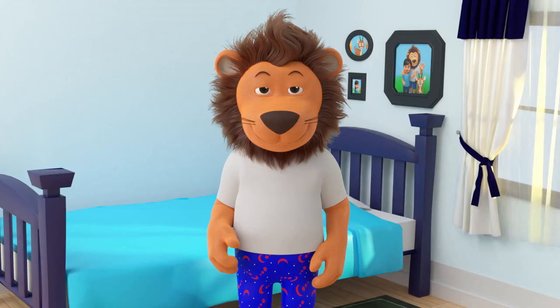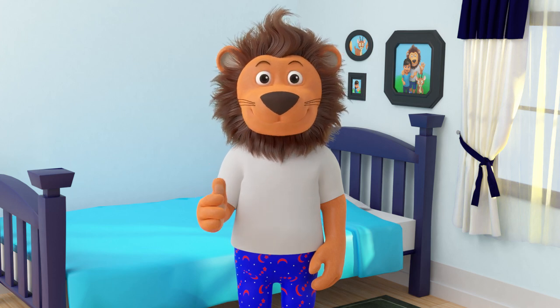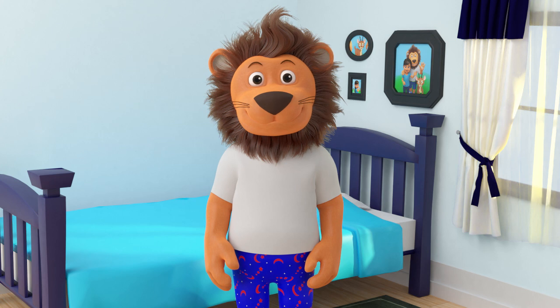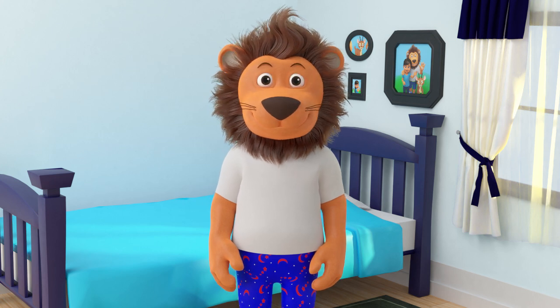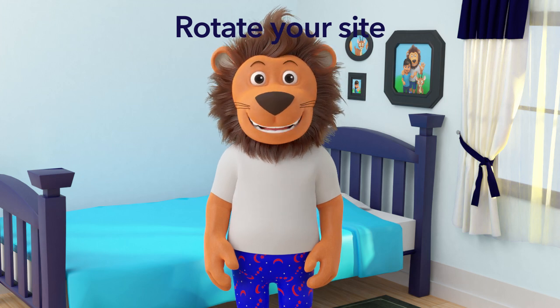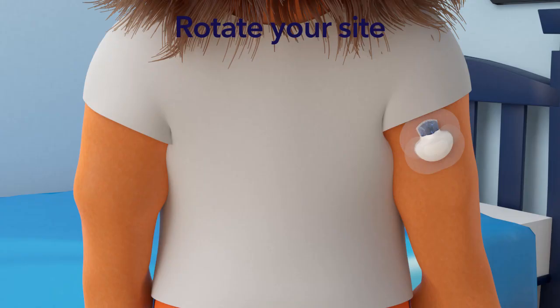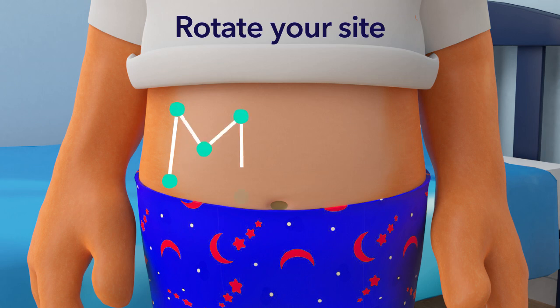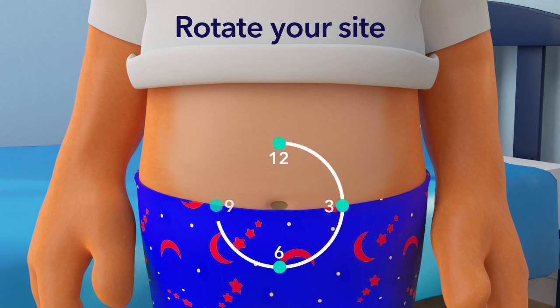Your parents may do this with you now, so you can start learning how to do it yourself one day. When you put the new sensor on, it needs to be placed in a new space on your body. We call this rotating your site. For example, if your old sensor is on your right arm, your new sensor can go on your left arm. You can rotate your site in an M or W shape, or rotate like you're going around a clock, as an example for a sensor that can be placed on the tummy.